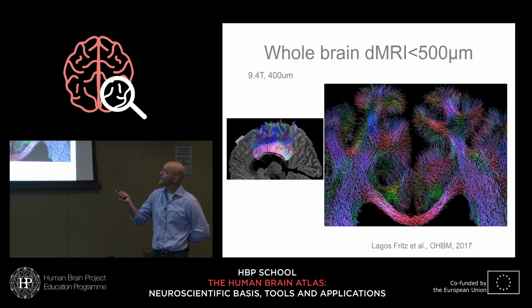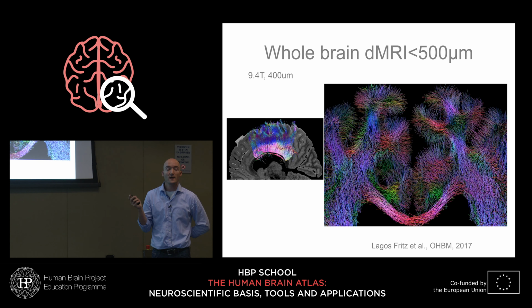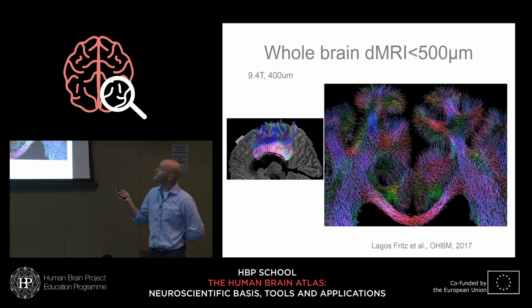Here's the corticospinal tract. But besides being able to follow those tracts, you can see that I didn't quite line out white and gray matter here, but here at the edges, you're going into the gray matter, and you can see you can follow the directions into gray matter. So you now get gray matter contrast as well, and you can see that dominant radial diffusion that you might also remember from the myeloarchitectonic picture in many parts of gray matter. You can start to see that. And so there is some hope of being able to track fibers with tractography techniques into gray matter rather than just stopping at the white gray matter boundary.